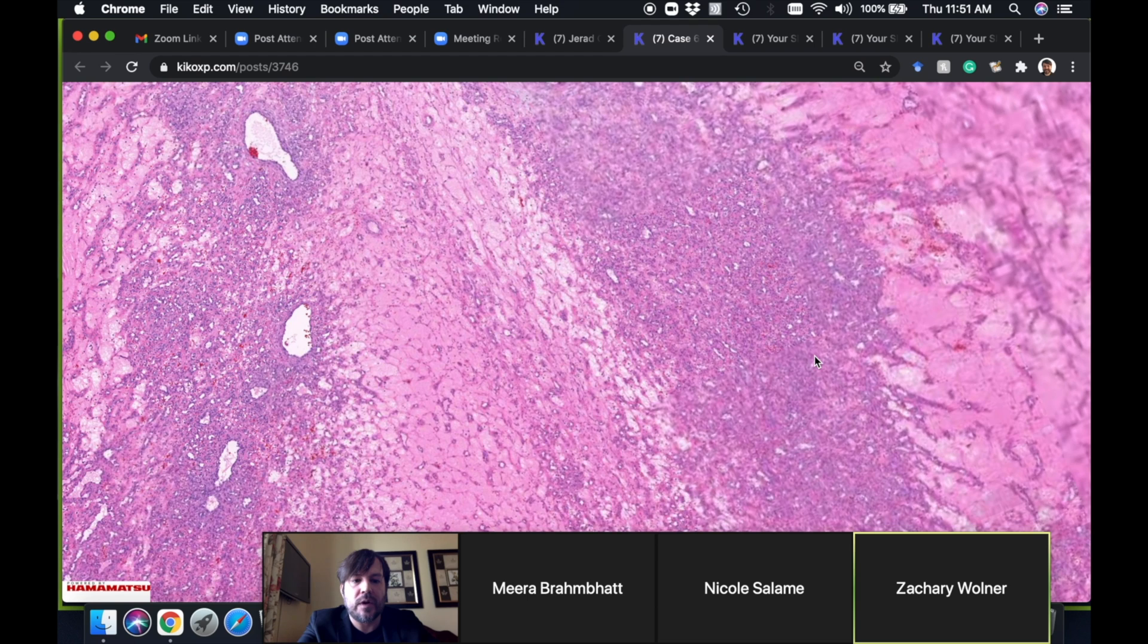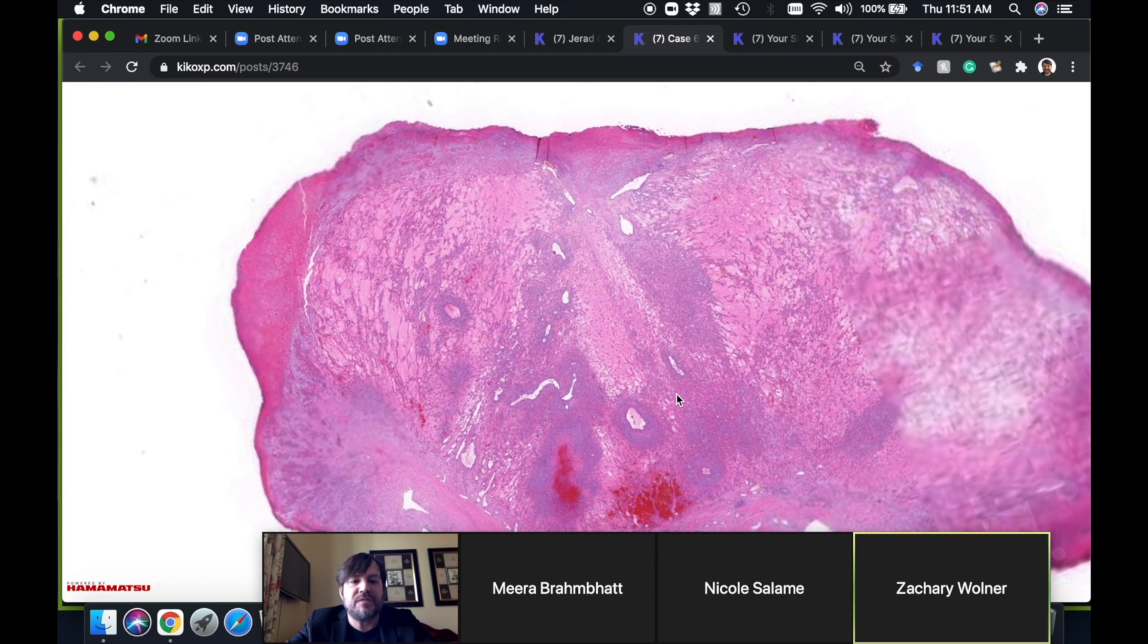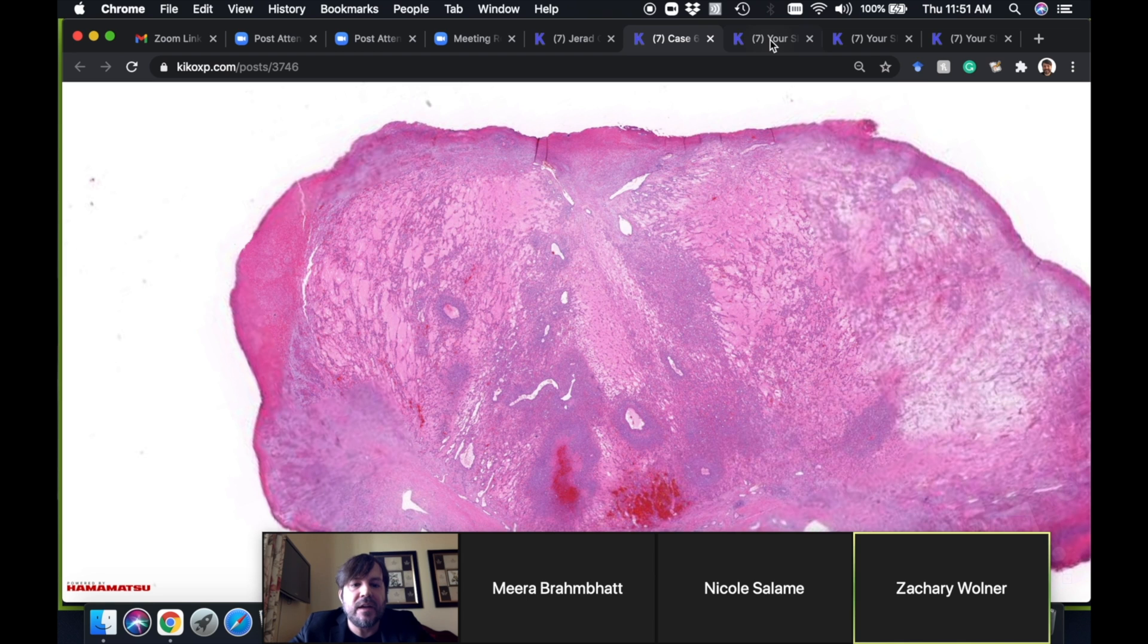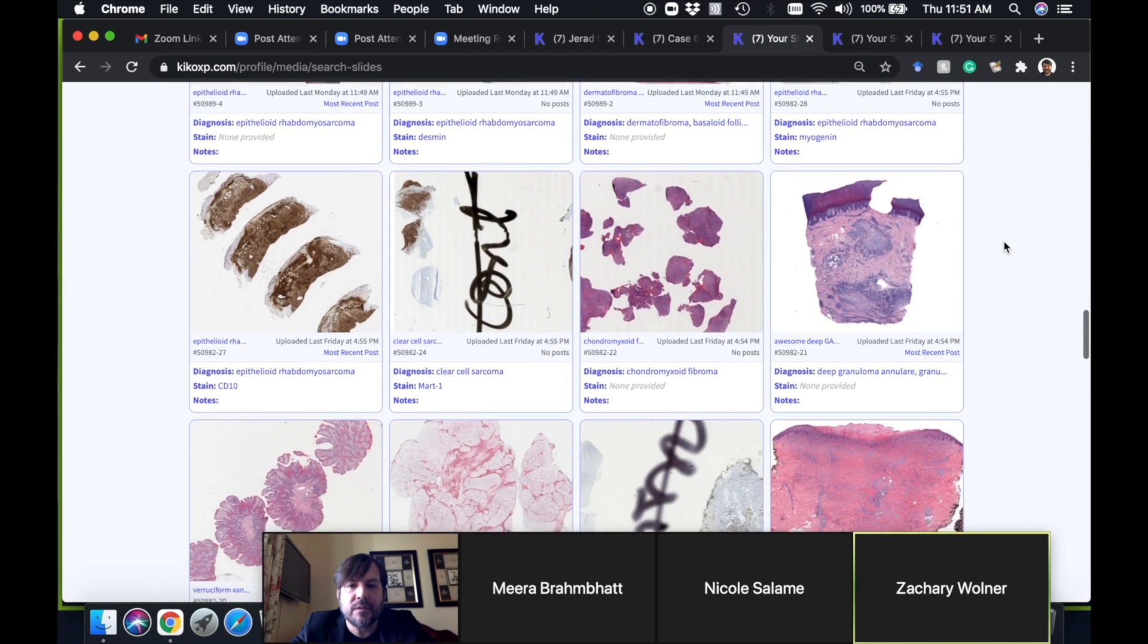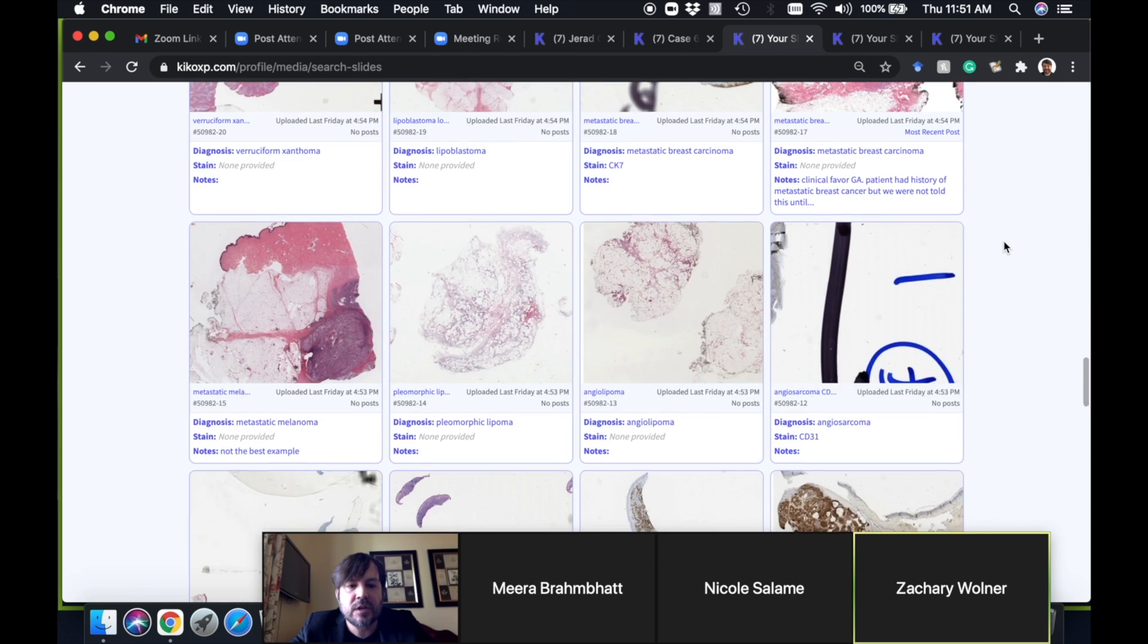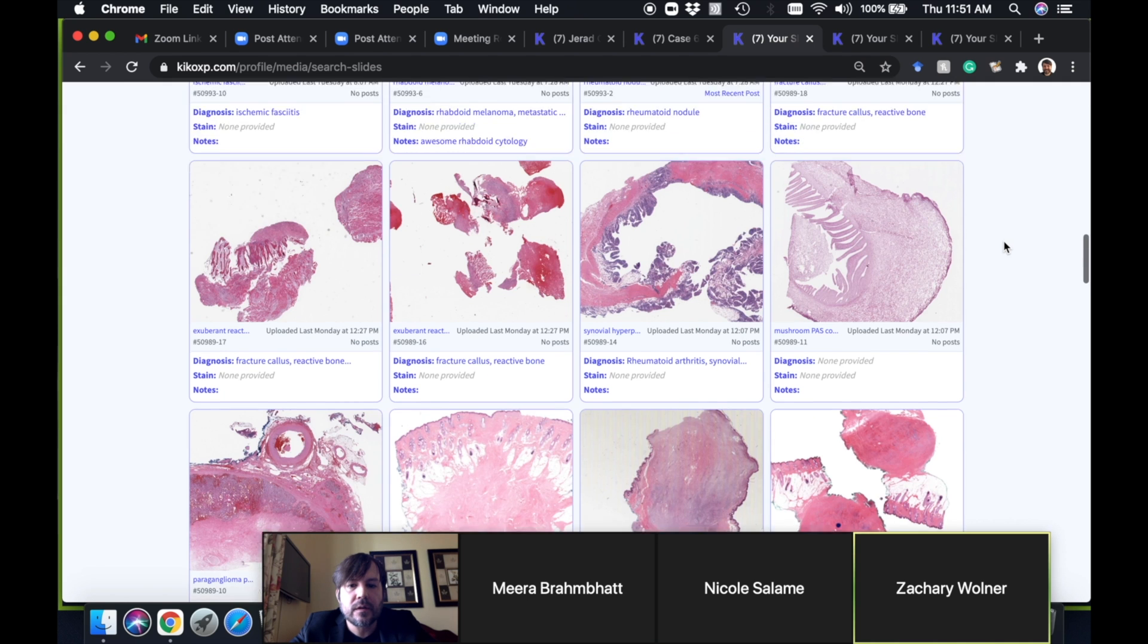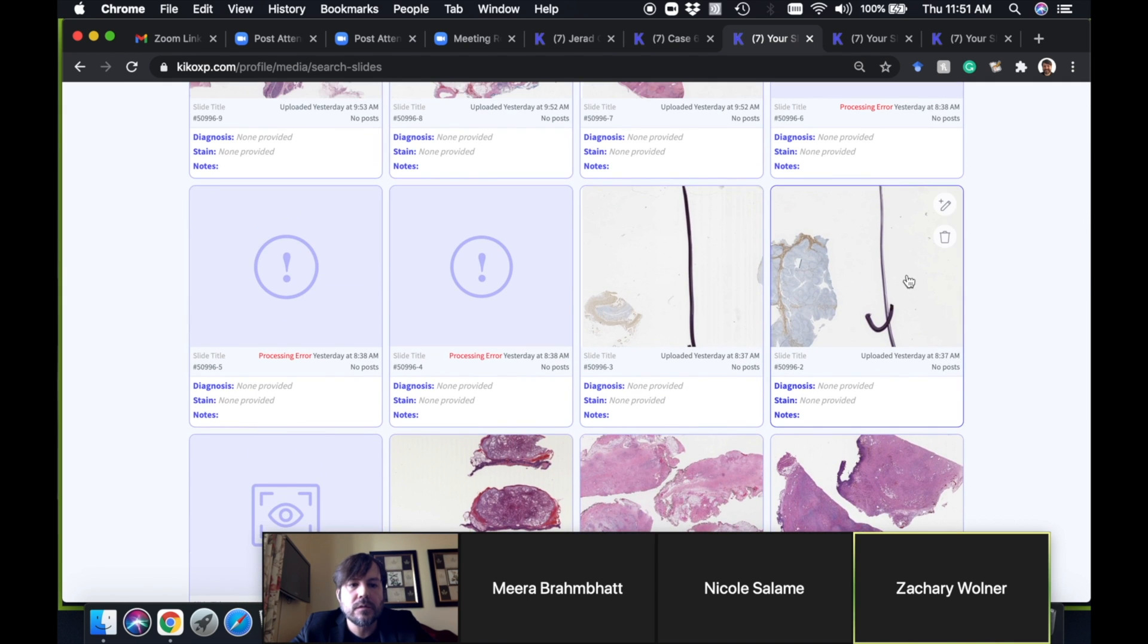Before we go to the bonus finding, let me show you the immunostains on this case. For teaching purposes I did immunostains here—I don't think we needed that for the diagnosis, but we just did them, no charge, for teaching.